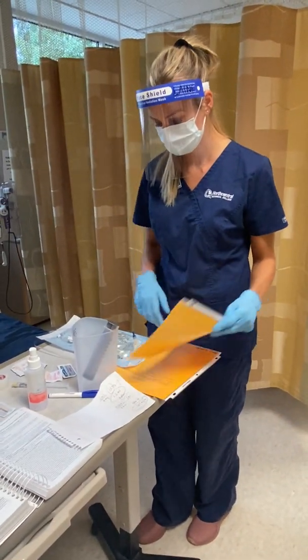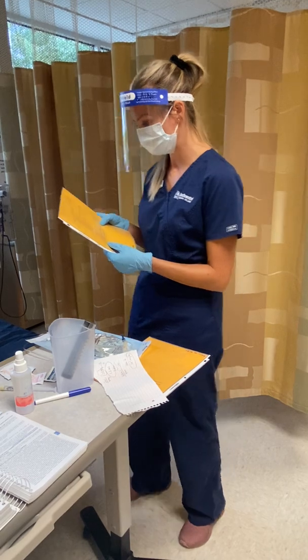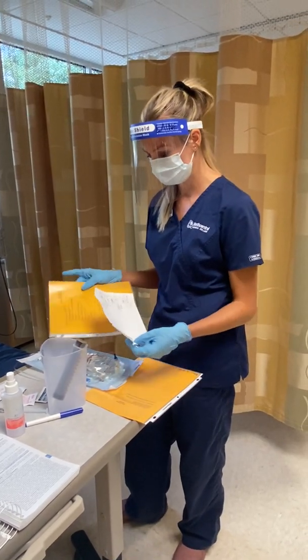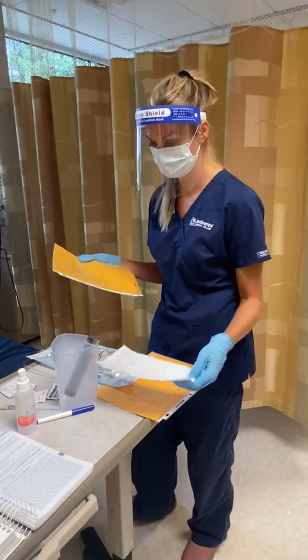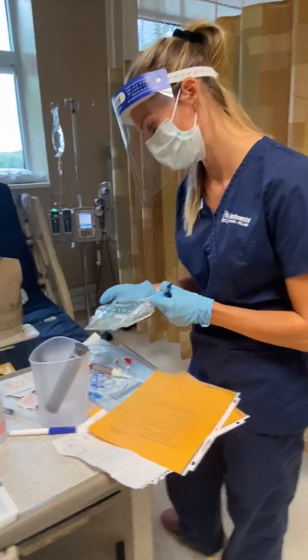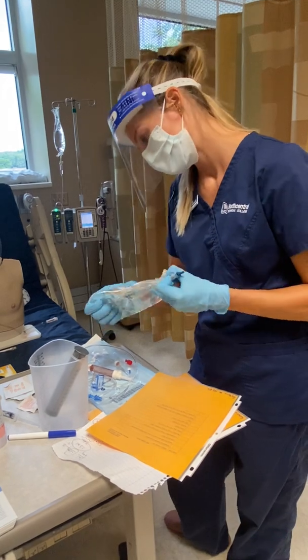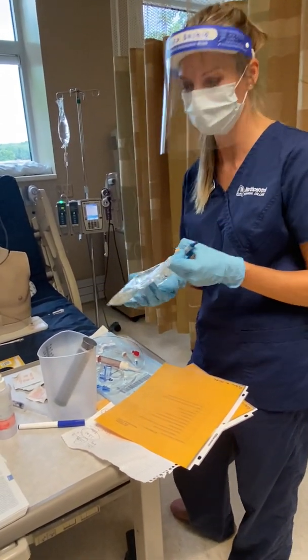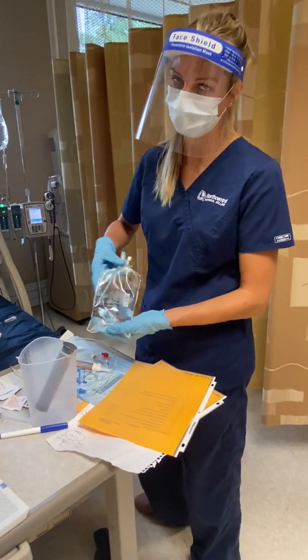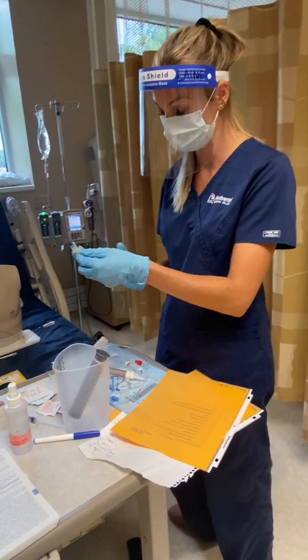All right, so I'm going to grab your chart here, and I see that she has an IV bolus of 500 mils of normal saline to infuse over 3 hours. I did my math, and we're going to be running that at 167 mils per hour. So let me grab this. I've got 0.9 normal saline, 500 mil bag. I'm just going to check the expiration date, and check to make sure that there's nothing in this bag and that everything looks clear. I'm also going to keep in mind compatibility with what she has ordered and what she has running, and she just has normal saline running right now, so it's obviously compatible with that.